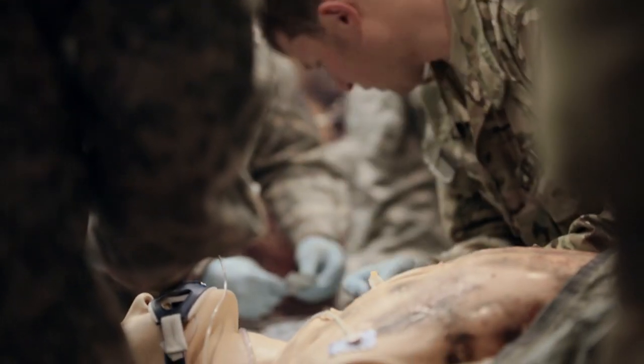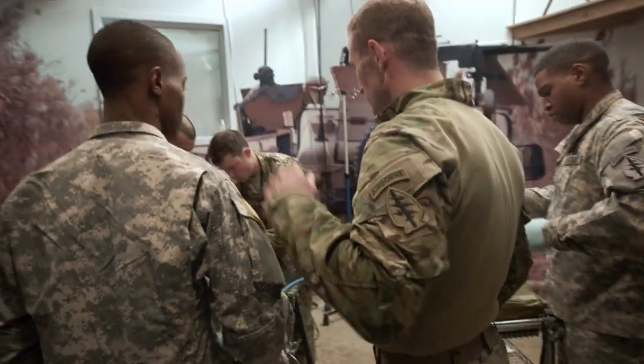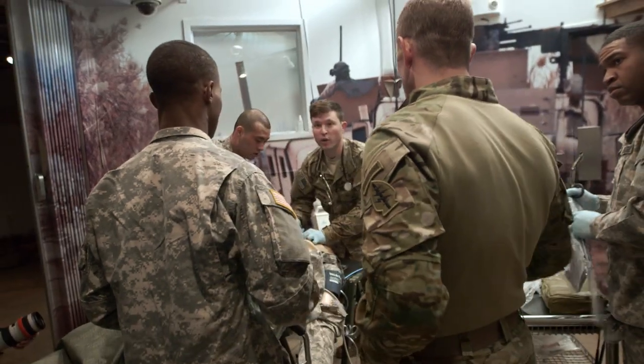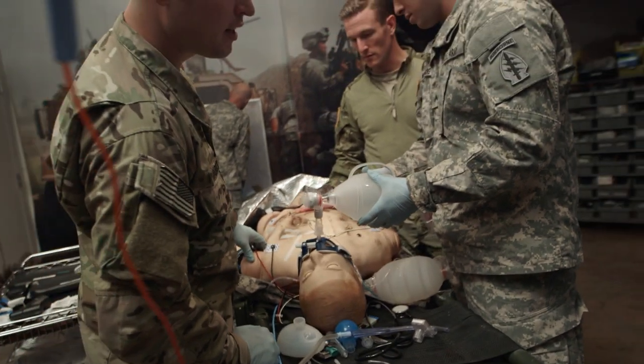So the medic and I will be kind of geeking out on medicine stuff, and we'll be trying to teach some of these non-medicine folks a little bit of what we're doing. We need an escharotomy here. His compliance isn't good, and he's not moving a lot of air right now.